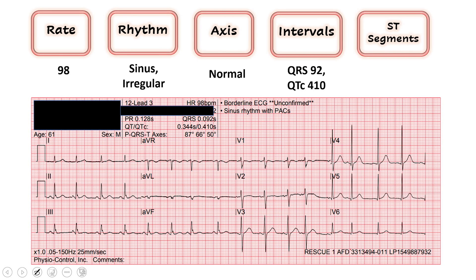Lastly, we save our ST segments for last. This is where we're looking for any ischemic changes — ST elevation, depression, T wave inversions — and we do this in territories. Leads 2, 3, and AVF are our inferior leads, and these look good. I don't see any T wave inversions or ST elevations. Moving to high lateral leads 1 and AVL, everything lines up well with the baseline. Moving to the septal and anterior areas, again no really concerning ST elevations or T wave inversions. So overall I would call the ST segments normal.